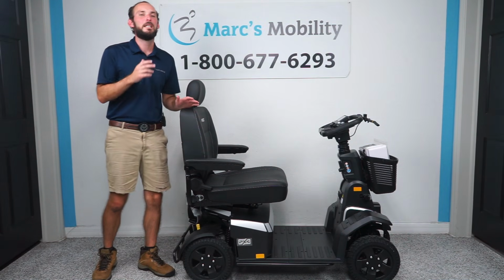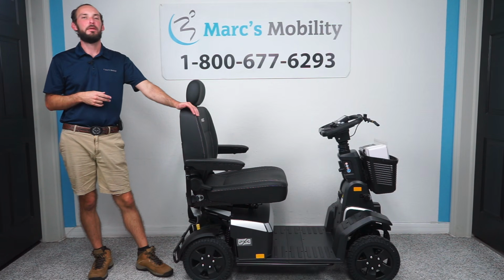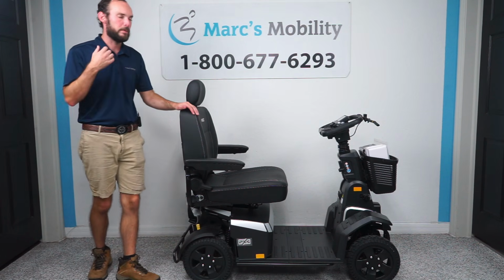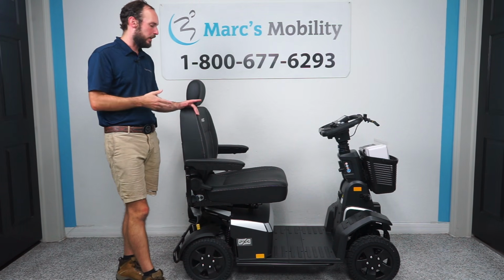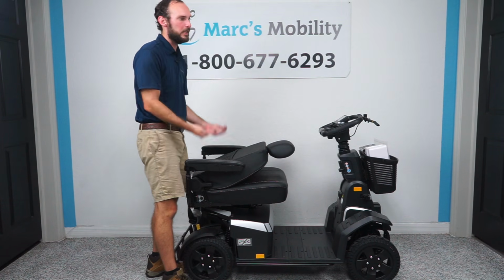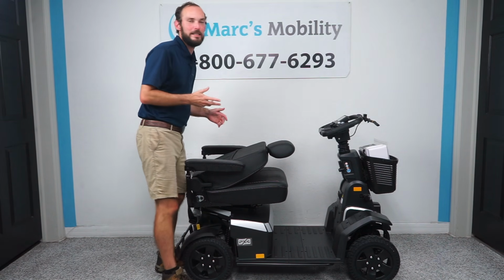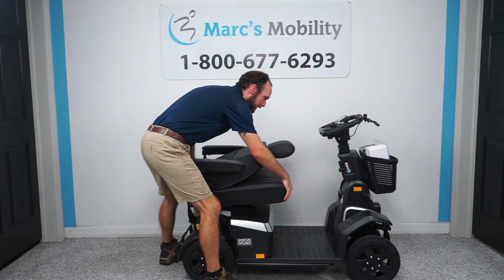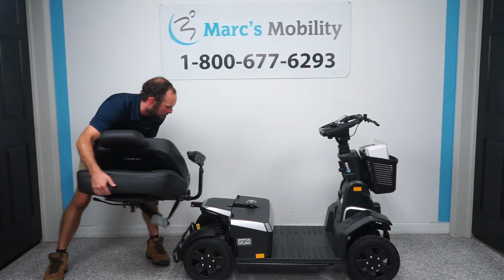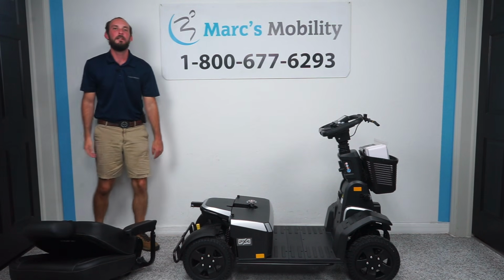In order to access the batteries on this unit, you're going to want to take the seat off. I would recommend a second person because this seat can be heavy, especially if you get one of the larger seats. But if you're going to do it by yourself, we're going to go ahead and fold the seat down, and then the seat just lifts straight up. You don't have to do any handles or anything, but like I said, it is heavy. It might take a couple attempts, but we are going to lift it straight up. And then set it on the ground just like that.